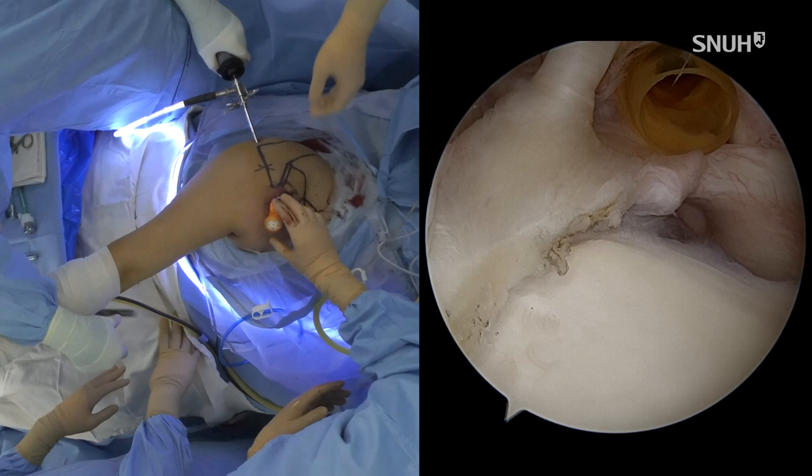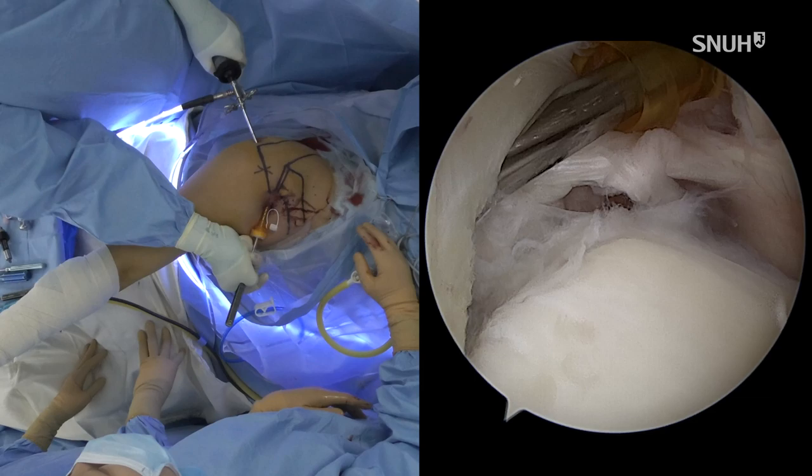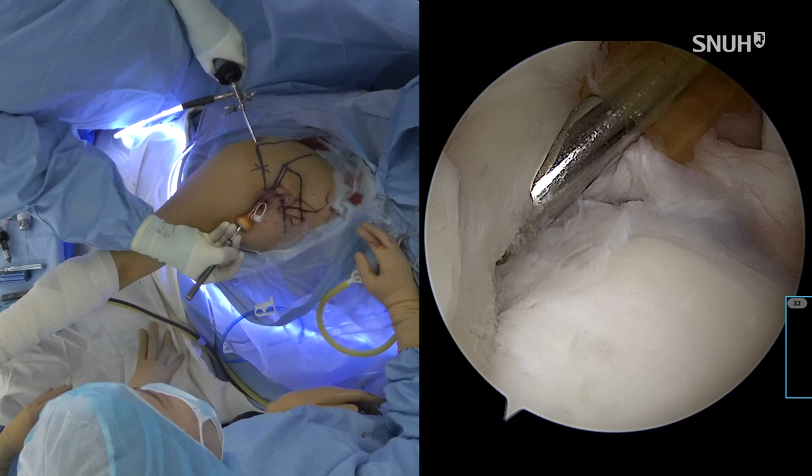Elevator, down, upward. SLAP repair does not take a long time, so it's better to have enough time for the decompression if you want. I can feel the bony touching here. Something is coming out that way.